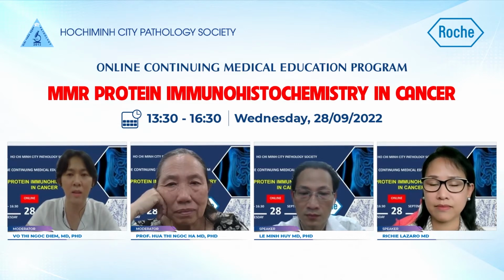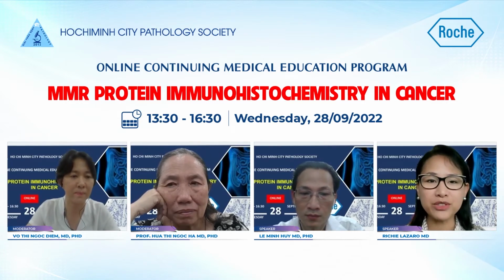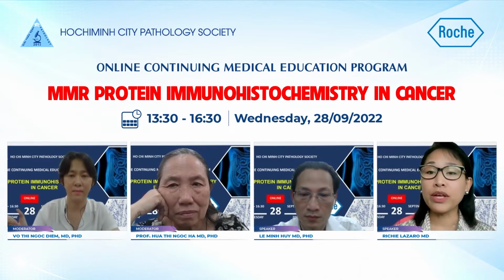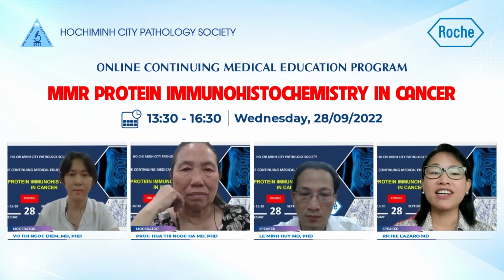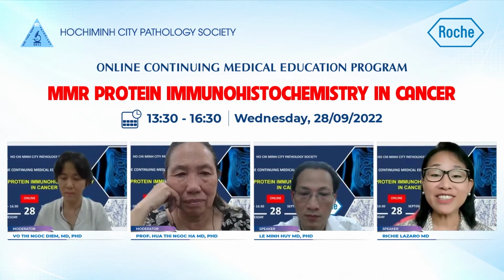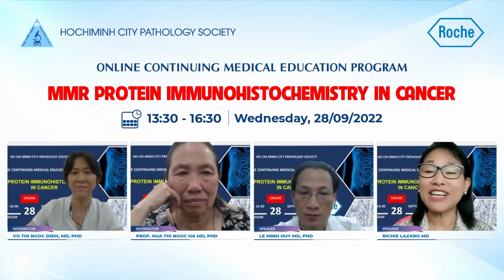Richie, please answer the question. Yeah, so for question number 2, right? What part of the tumor will we interpret MMR? In my practice and in my opinion, I will evaluate all tissue, including benign areas.